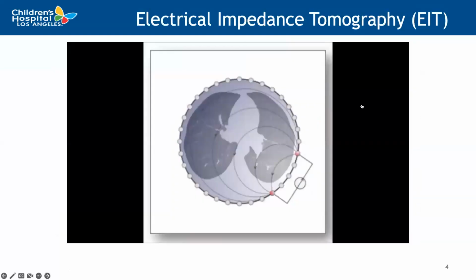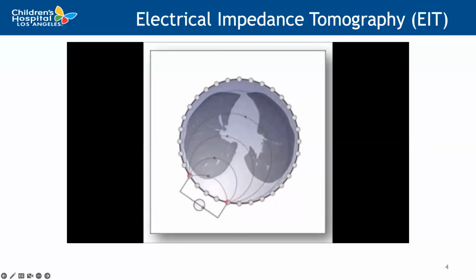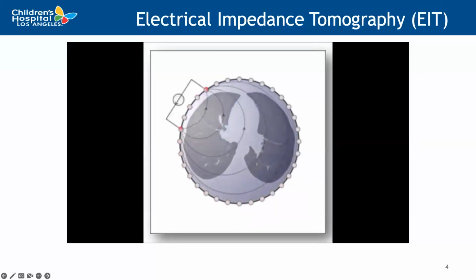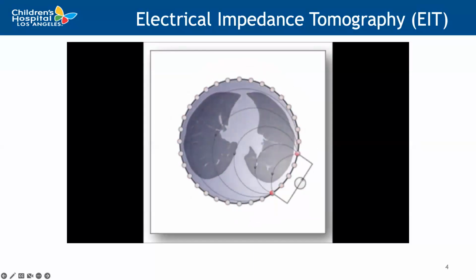In the introductory video, you may have seen this image already, but this is just a representation of how those electrodes are continuously conducting electrical signals and how the adjacent electrodes are then taking that and producing the image that we see on the screen.